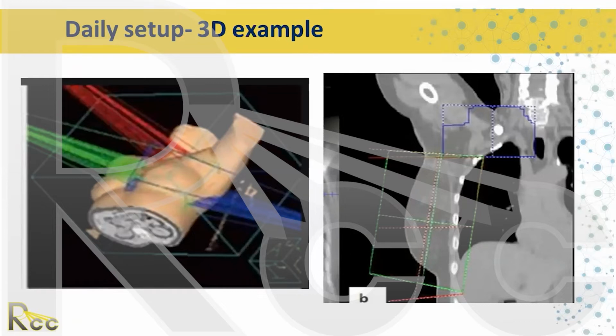Okay. This just shows you again the matching superclav field on the B with the medial tangent. So you want to visually confirm, if you're not doing IGRT, that the edge is matching where it's supposed to be. So no overlap, no gaps. We'll usually draw the medial tangent, the superior border on their skin. And then when we shift, we'll match it to the superclav to make sure it's abutting. And I think that's the easiest way to make sure that every day you're matching correctly.